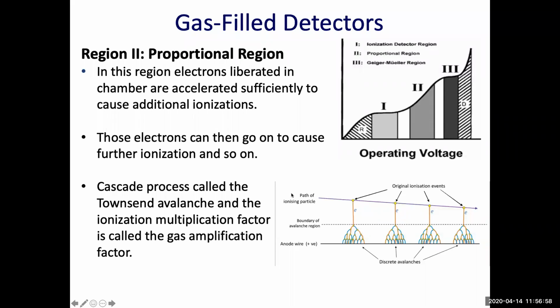Regarding the question here, yes, we have a calibration factor for each radionuclide used in nuclear medicine. Okay, let's go back to this one, the gas-filled detector.